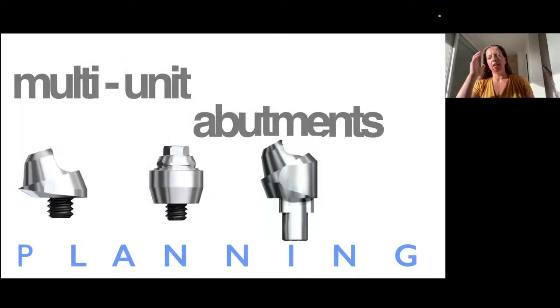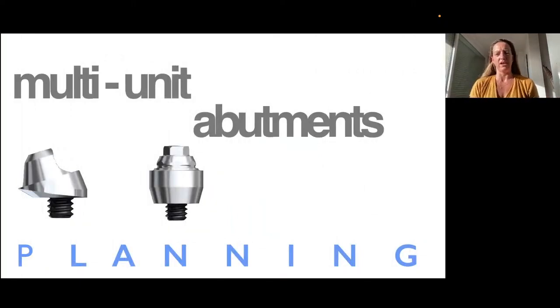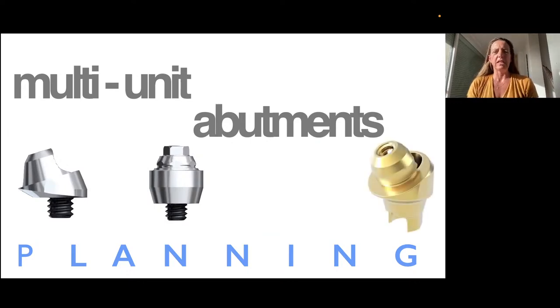Good. So again, in this case, you have to understand the abutments are very important. We have angulated abutments, we have multi-unit abutments. So every time that we go for more than 1 unit, if you are going to do a bridge, it's good that you plan also to have these multi-unit abutments. The multi-unit abutments are very, very helpful. You have them for the external connection and also for the internal connection.